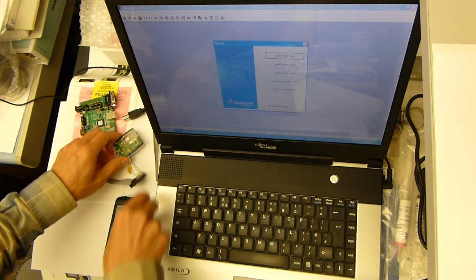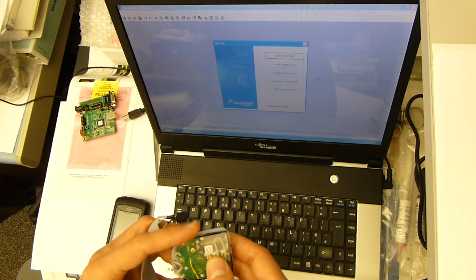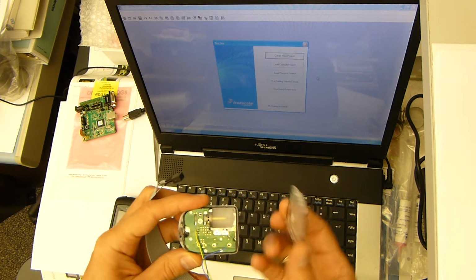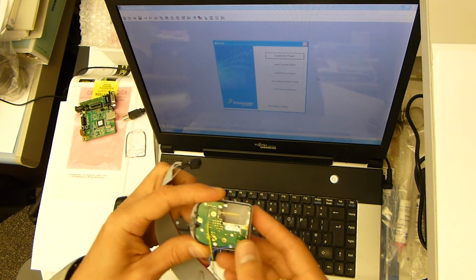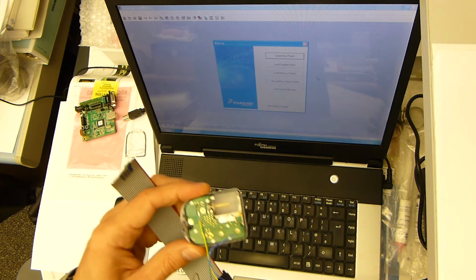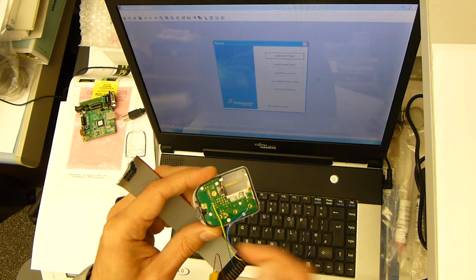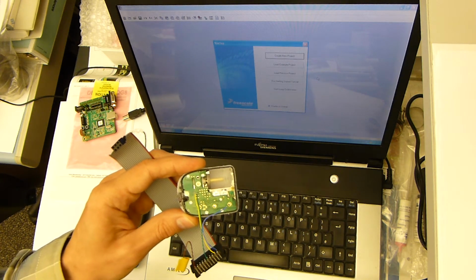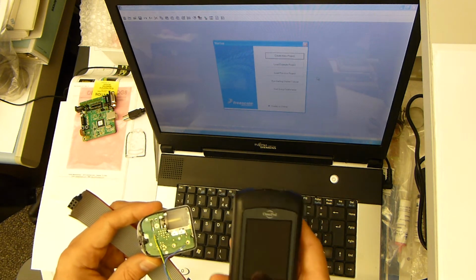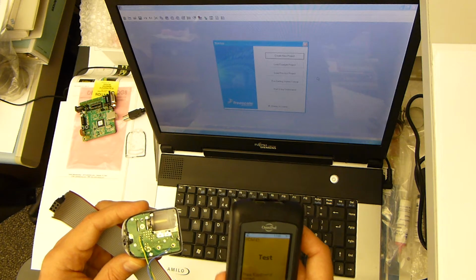So in order to upload and access the controller inside the pod, we need to open it first, and that was demonstrated in my previous video. So I will use the used pod that has been wired to the connector, and you only need three wires to reprogram the flash inside the controller. And this is what the PDM controller for the pod looks like.